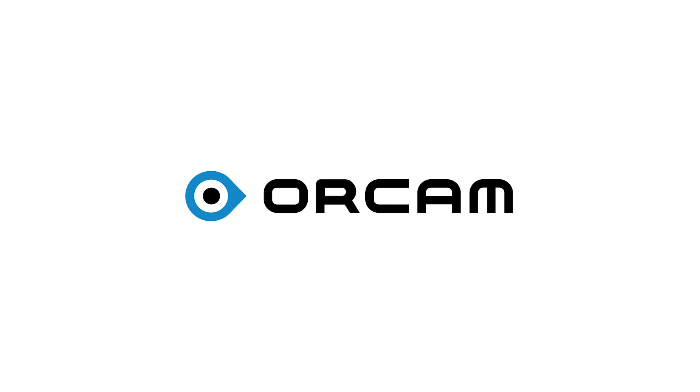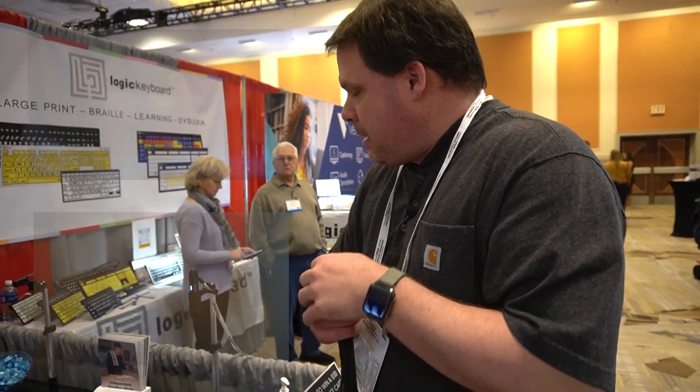We have stopped at the OrCam booth. You may have seen some of our past videos on the OrCam Reed and the MyEye, but we're specifically stopping to talk with Jason about the new stand that they've released for the OrCam Reed. Jason, can you tell us a little bit about the stand?